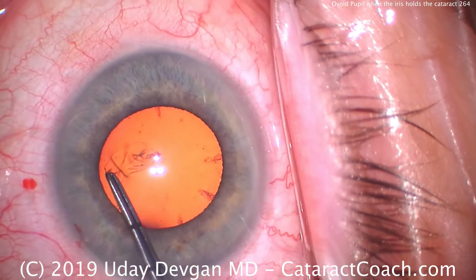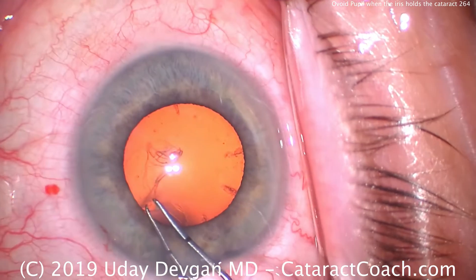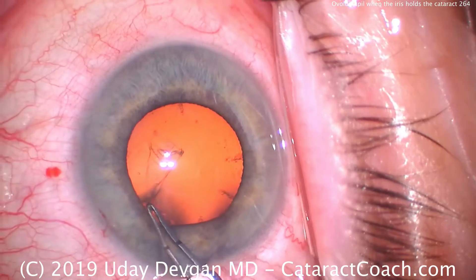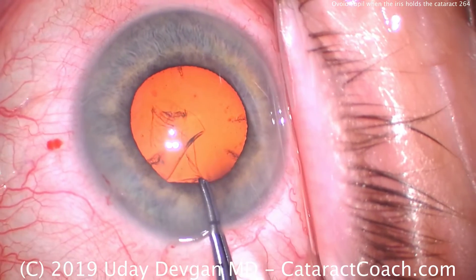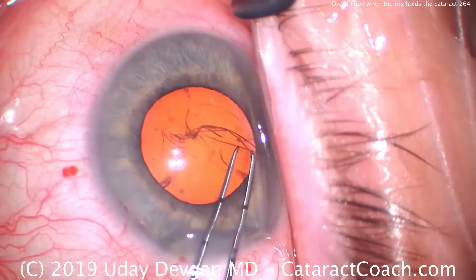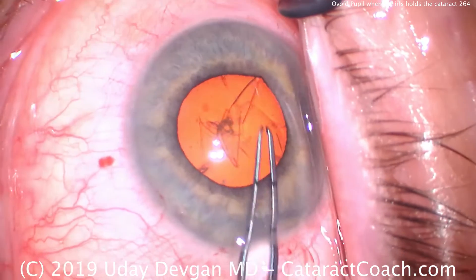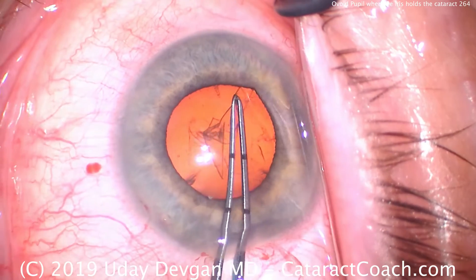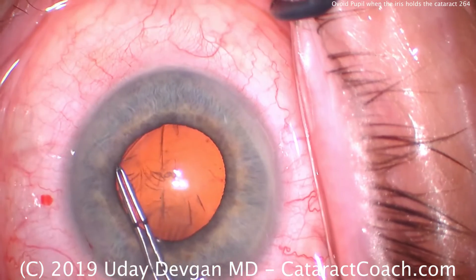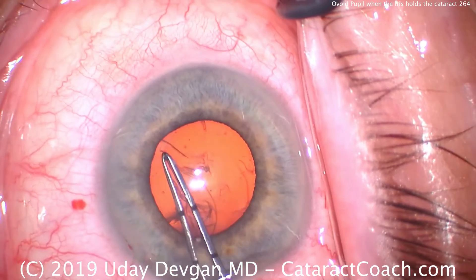Let's look at a different eye — here's a blue eye, a little bit larger on the pupil size initially. Again we'll make the capsular rhexis just outside the pupil, right under the iris. This is a four-and-a-half millimeter pupil and we'll make a five to five-and-a-half millimeter capsulorrhexis, so we don't see the actual edge of the rhexis — it's just barely hidden under the iris. This is important: do not make a small or tiny rhexis.